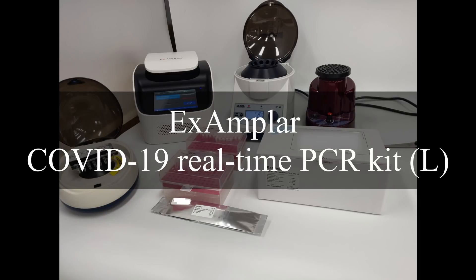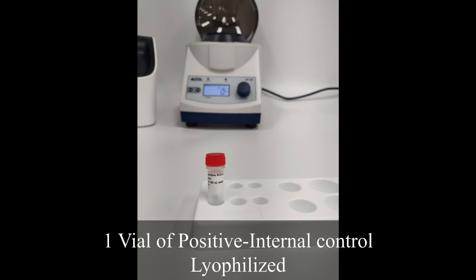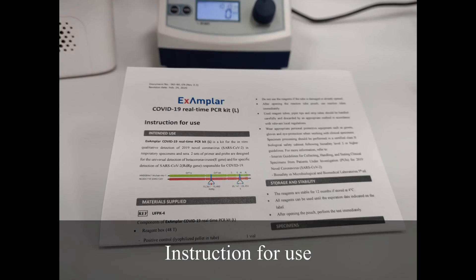Exemplar COVID-19 real-time PCR kit. Test materials: two vials of resuspension buffers and one vial of negative control, vial of positive internal control lyophilized, reaction 8-well PCR tube pouch, and instruction for use.